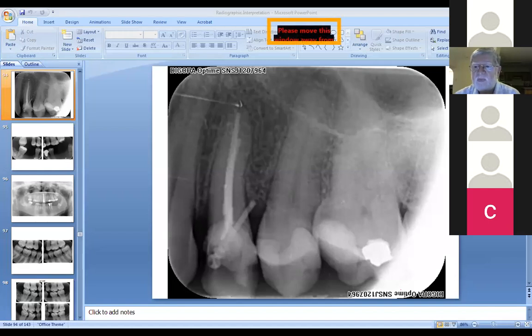For the 2 upper molars with food trap related caries, is it possible to remove and restore the 1/6 with a ceramic crown after the mesial part of the amalgam restoration is removed? And you can get some direct access to the distal part of the 1/6.